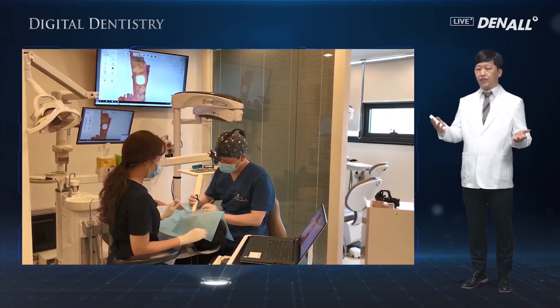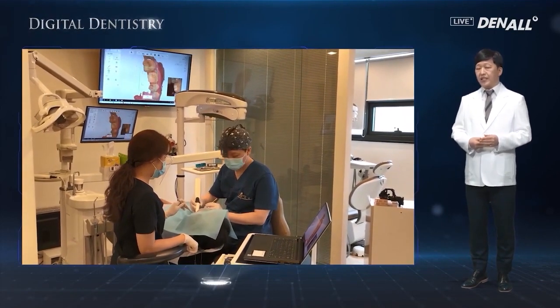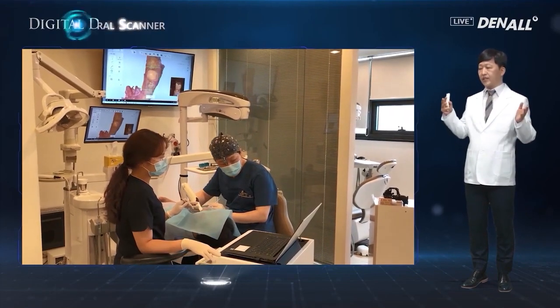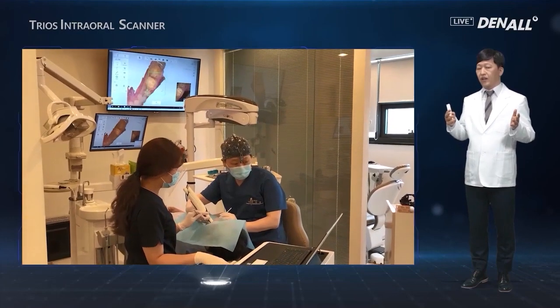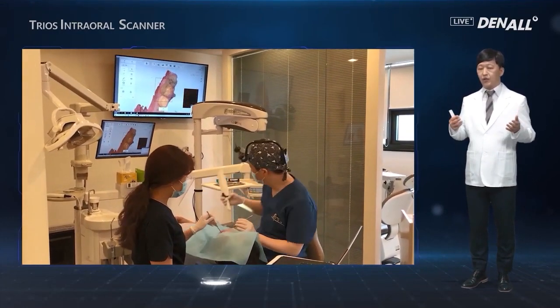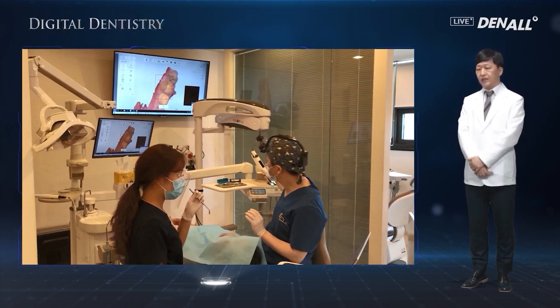This is the video of how we use the Trios in our clinic. When you use digital equipment, if you have a big screen on the wall, when you do the digital work, a lot of images can be shown to a patient. A big advantage, so when you set up digital devices, you can refer to this.